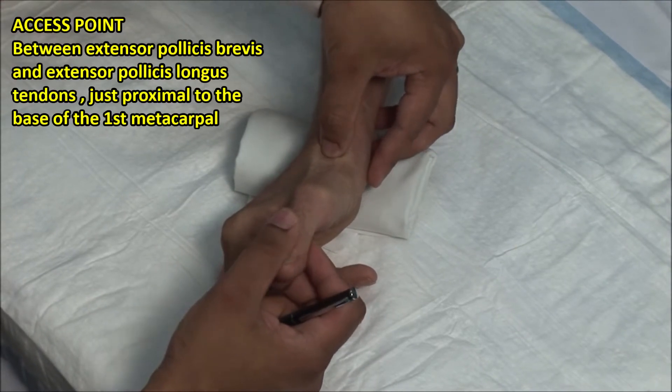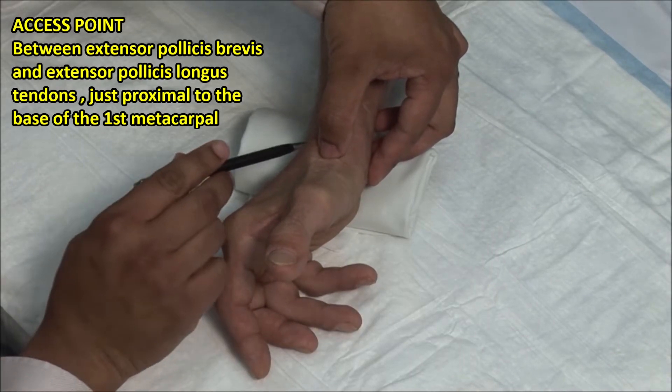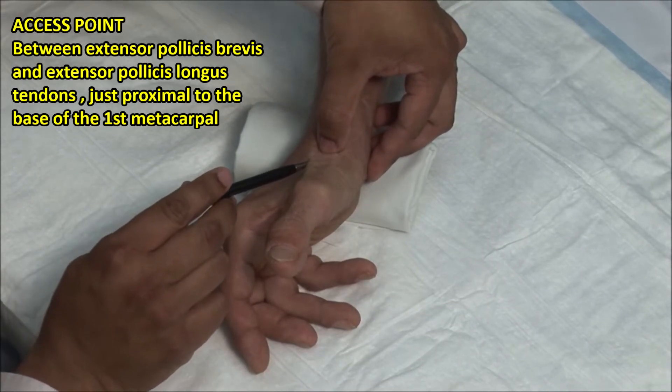The point of injection is between the extensor pollicis brevis and extensor pollicis longus tendons, just at the joint space.